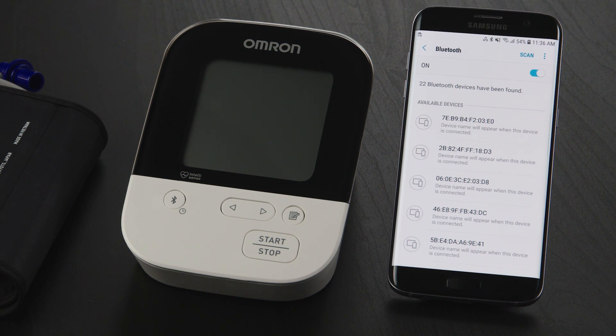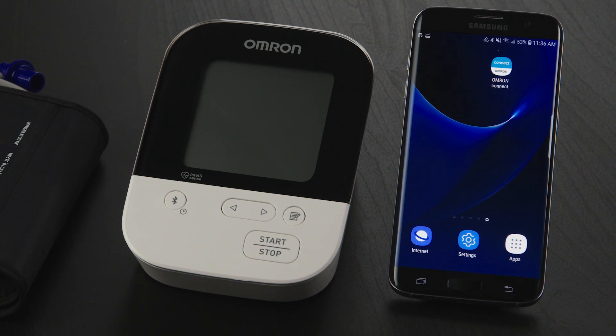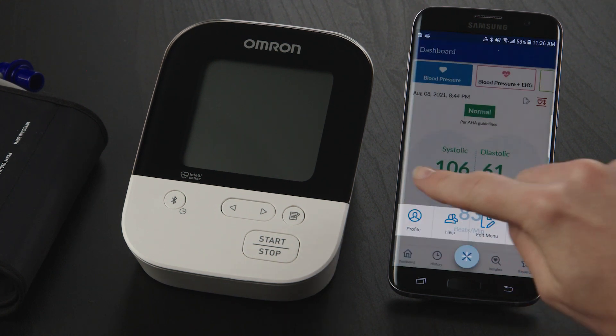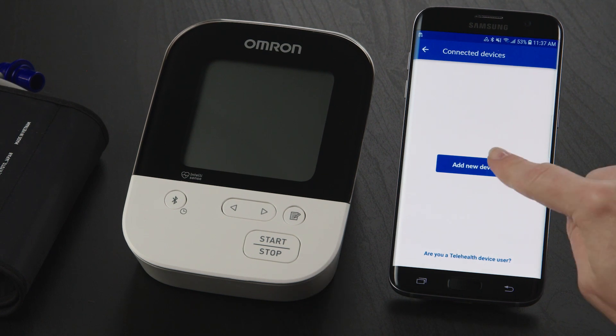Now you can pair your Omron blood pressure monitor. Go back to the Home screen and open the Omron Connect US Canada app. Tap on the plus sign icon, and on the next screen, tap the Profile icon. Then tap on Connected Devices, then the Add New Device button.